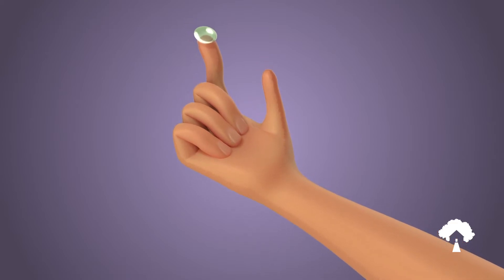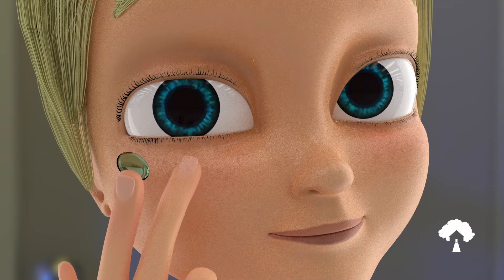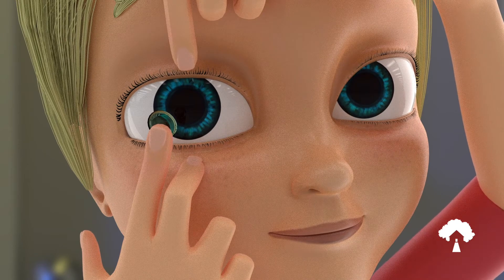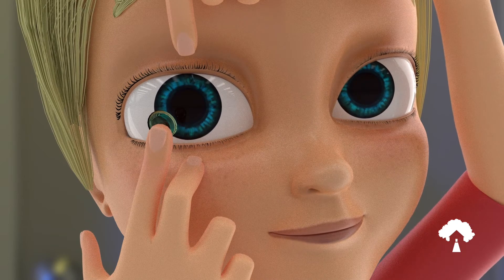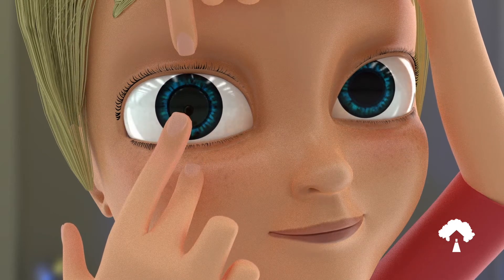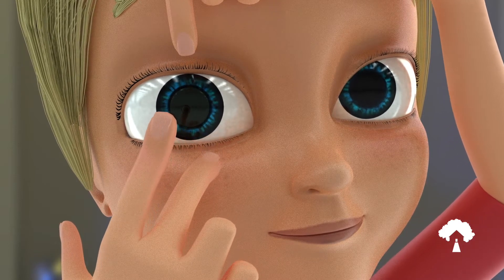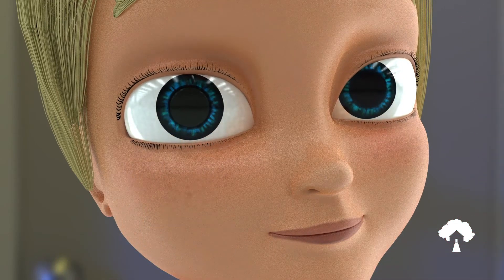Do not insert the lens if damaged in any way. While looking in the mirror, use the middle finger of the same hand you are inserting the lens with to pull down on your lower lid. At the same time, use a finger from your other hand to gently pull on your upper lid. While holding both lids open, insert the lens by using your index finger to gently place it on the colored part of the eye. Be sure to look straight ahead while inserting the lens to ensure proper placement. Once the lens is securely in place, slowly let go of both lids and blink your eyes.